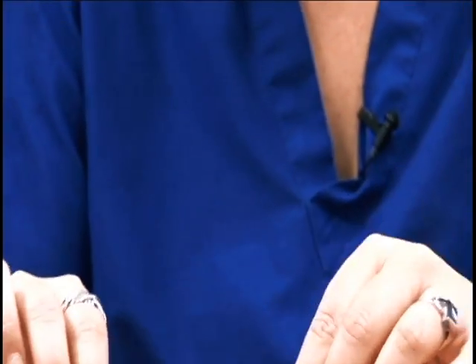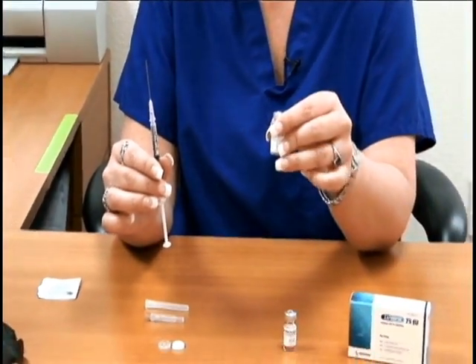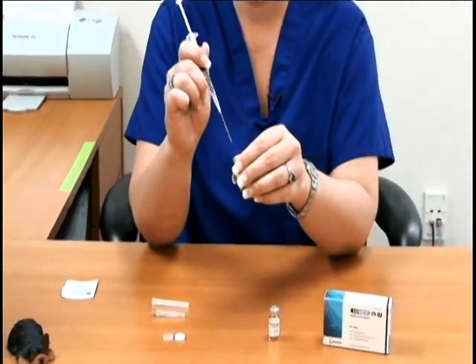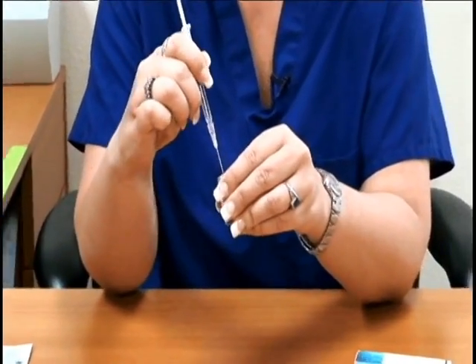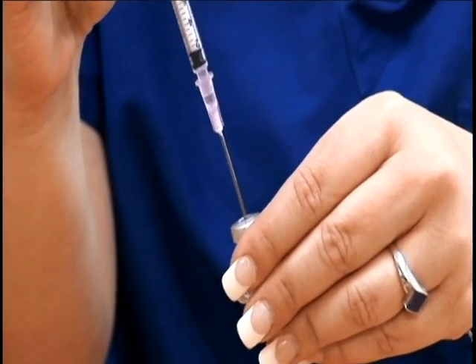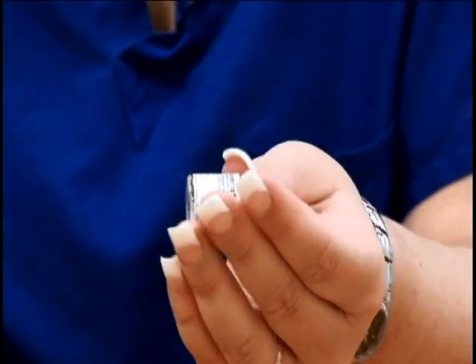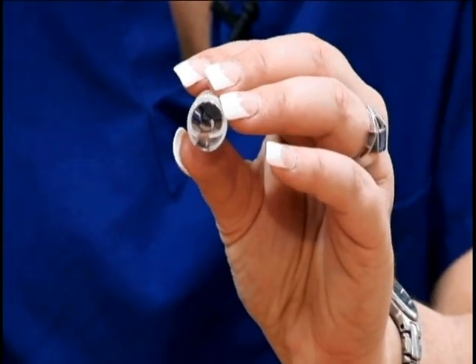Then you'll remove the needle from the vial and take the vial of powder and inject the medication into the vial of powder. You're going to mix it up. You don't want to shake it so you don't get any air bubbles in it.